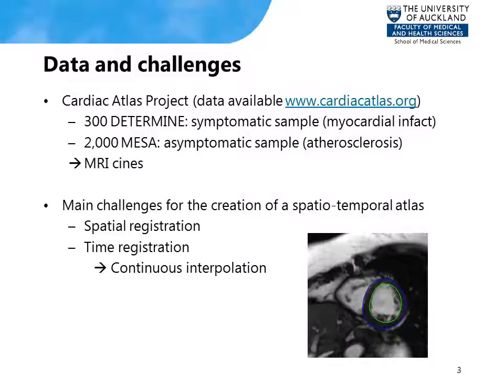To create this atlas, we're going to have to deal with several problems. How do we register or align all shapes to a common template? How do we align the models in time? The second question is going to lead us to find a continuous interpolation.